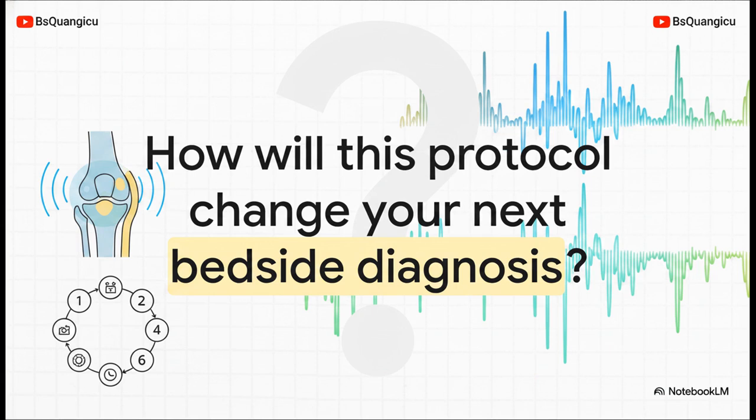Now that you know the exact sonographic difference between a tricky physics artifact and a true structural rupture, how is this 6-step protocol going to change your next bedside diagnosis? Mastering this step-by-step ultrasound workflow directly empowers you to stop guessing and start actually seeing. It lets you deliver faster, more precise, and highly confident patient care right there at the bedside.